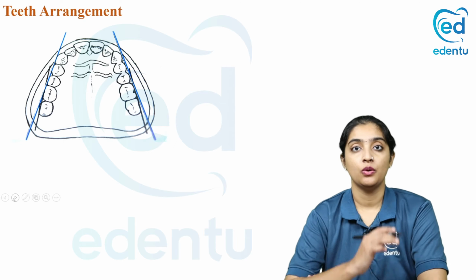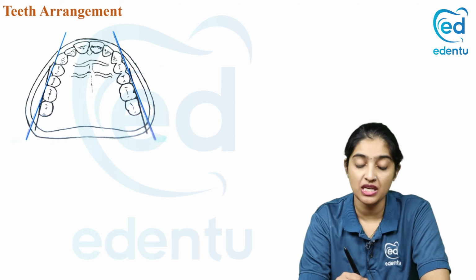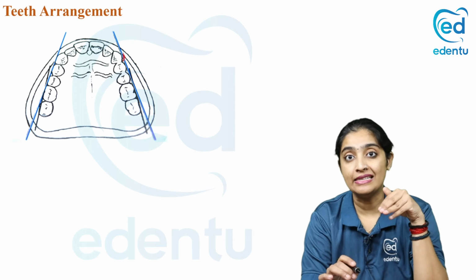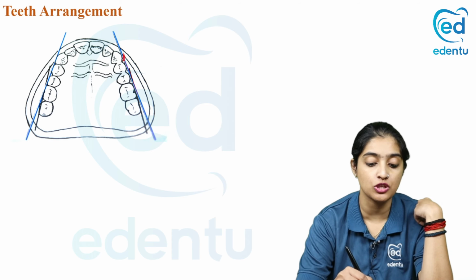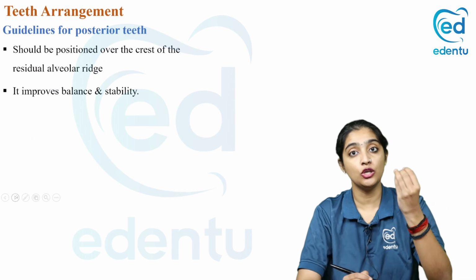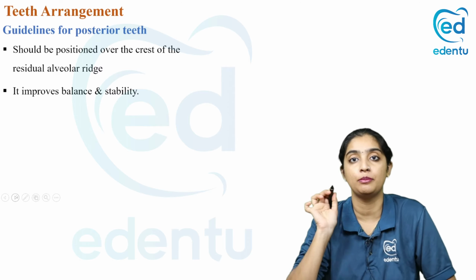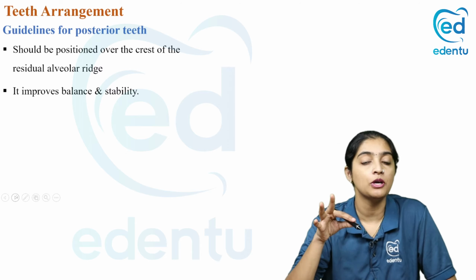In the upper arch, when you're arranging your posterior teeth, all the posterior buccal cusps will follow the distal slope of your upper canine. Whereas in the lower, the distal slope of your canine will be followed by the central groove of all your mandibular posteriors. That should be the ideal positioning of your posterior teeth based on Pound's concept.